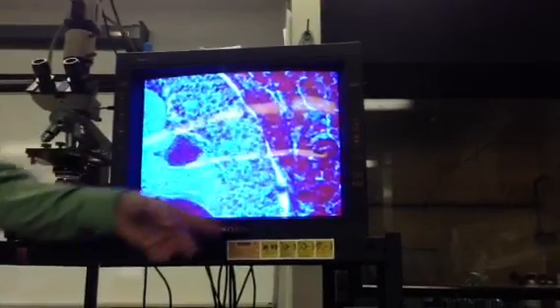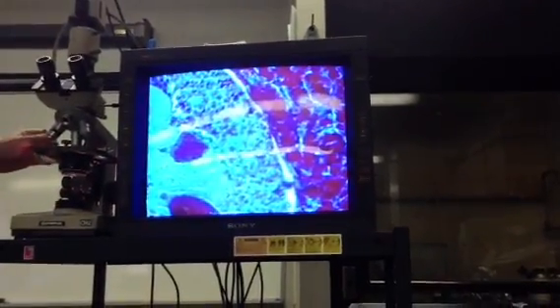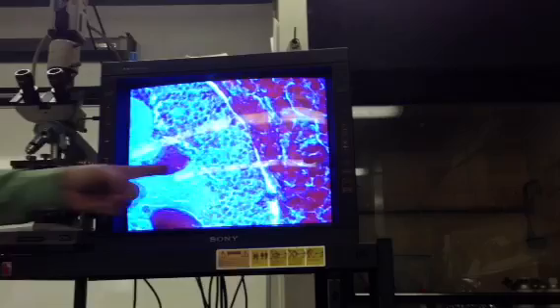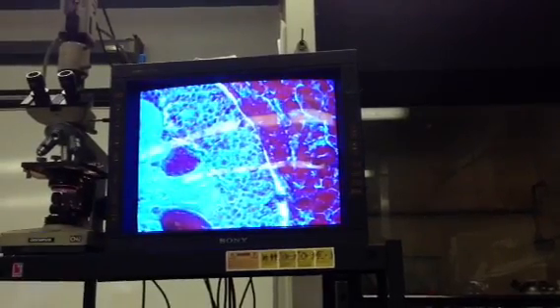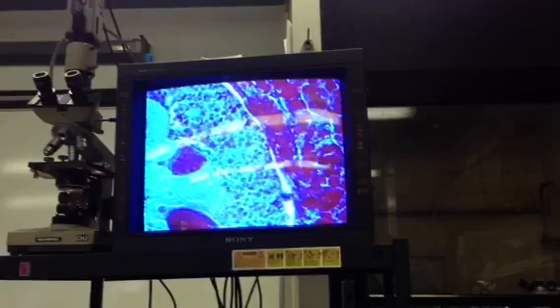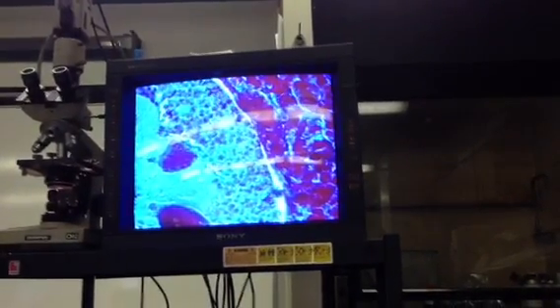So if you see the pituitary, if it's a high power slide and I ask you for a particular cell type, it's the acidophils that are bright red and they make growth hormone or prolactin, actually. Most of them are dedicated to one or the other.